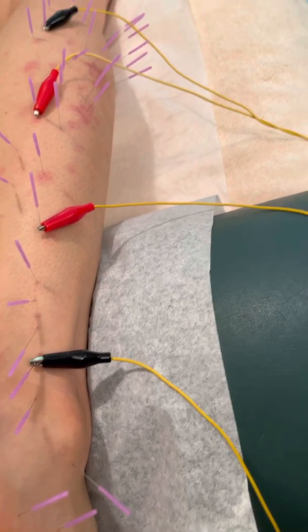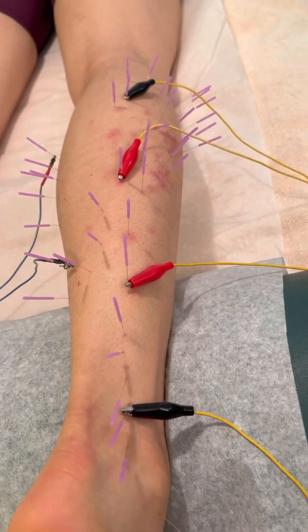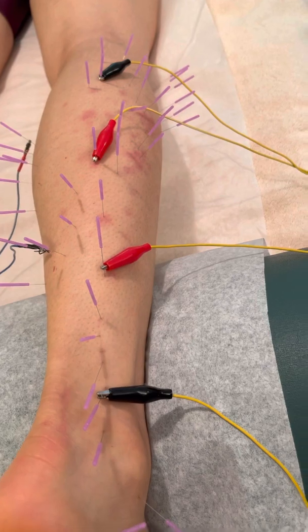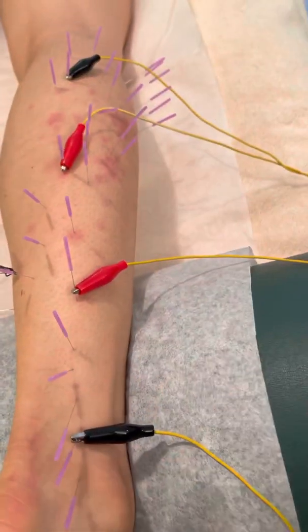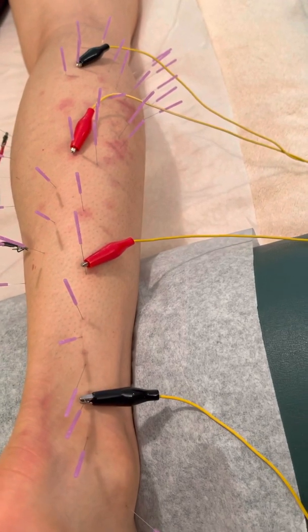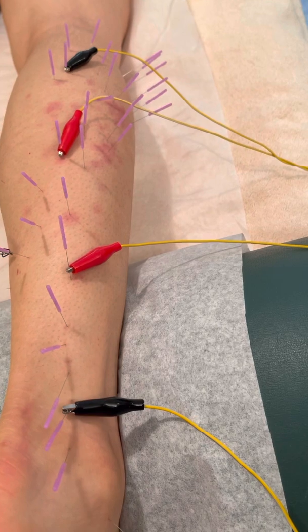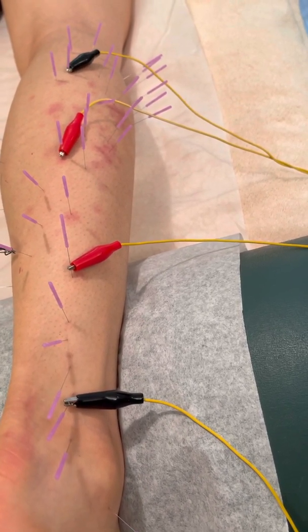And what's happening is that sometimes, because of the nature of the electrical impulses in muscles, I just notice I'm increasing these two, but it's making all of them stronger. Did you notice that too? Yes. But it's good. Feels good. Should I go stronger yet? A little bit stronger. You say when, or stop me before it gets too strong.